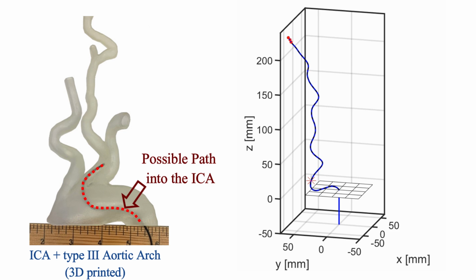These results will inform future design iterations of multi-articulated catheters for endovascular interventions.